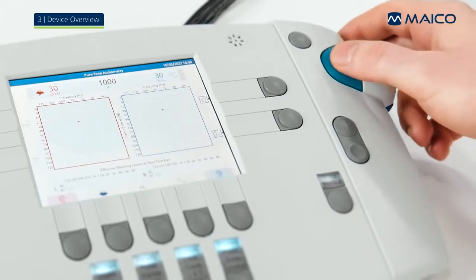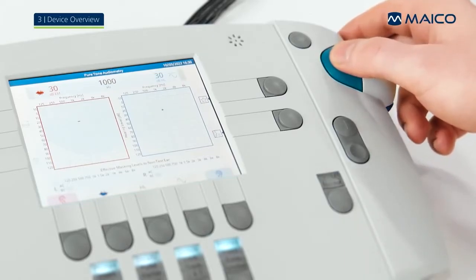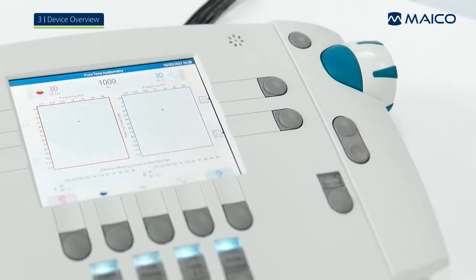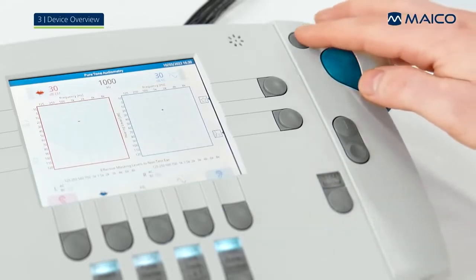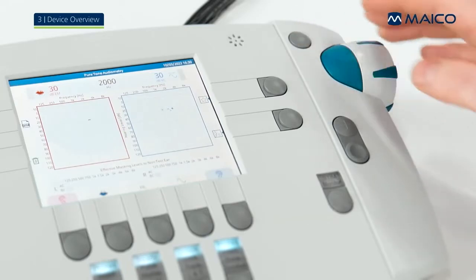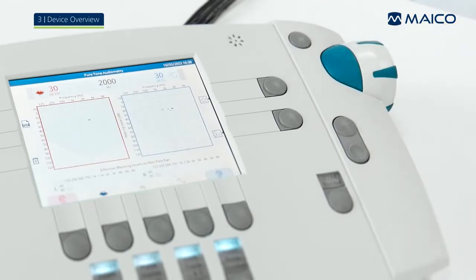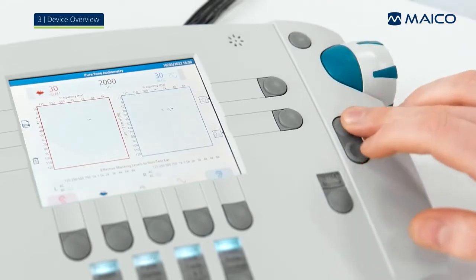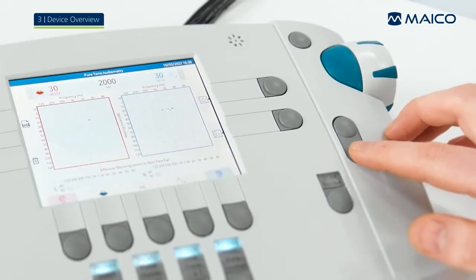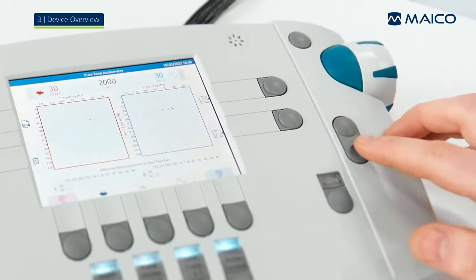The present keys are used to present or interrupt the signal or masking noise, or confirm selection in menus. The store keys allow you to store single results, or no response results with a long press. The plus and minus keys change to a higher or lower frequency in the tone tests and allow you to enter a correct or incorrect answer in the speech tests.